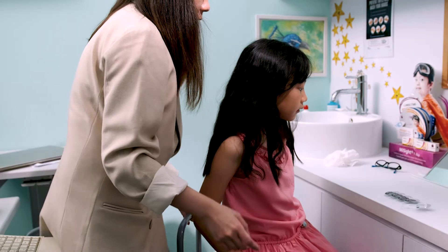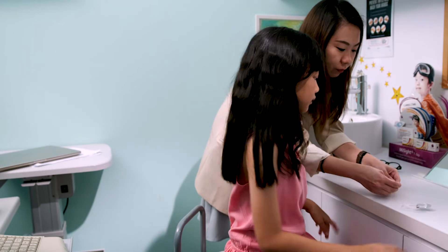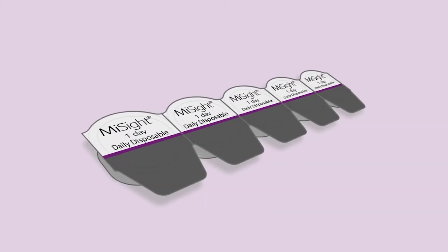Putting contact lenses on and taking them off becomes easier with practice — the more you do it, the better you'll get. Before you know it, you'll be an expert. Let's get started. You'll need your contact lenses, some soap, a well-lit mirror, and a clean non-fluffy towel.